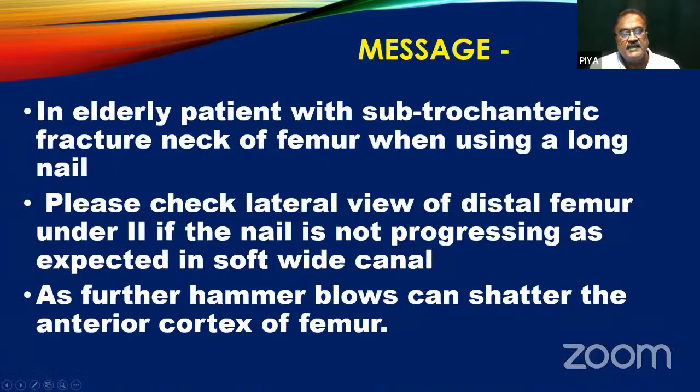So the message: in an elderly patient with a subtrochanteric fracture of the femur, when using a long nail, please check the lateral view of the distal femur under image intensifier if the nail is not progressing as expected in a soft, wide canal, as further hammer blows can shatter the anterior cortex of the femur.